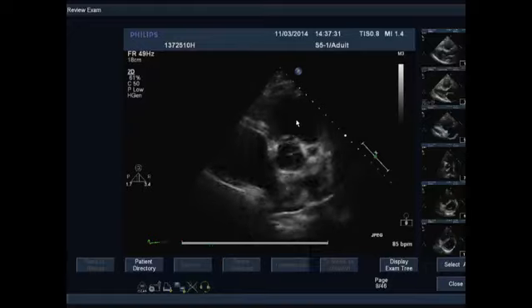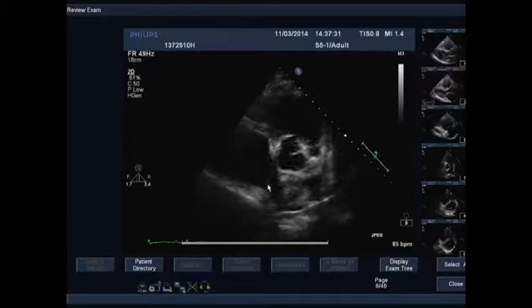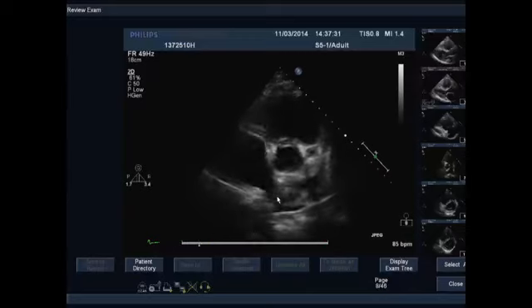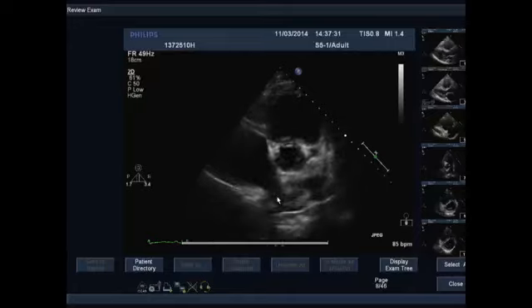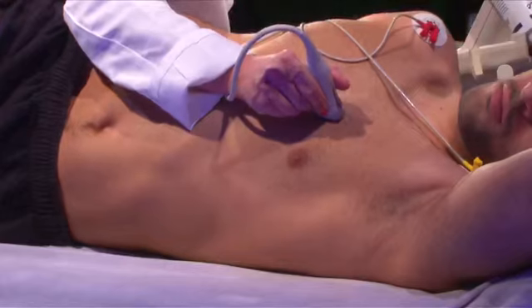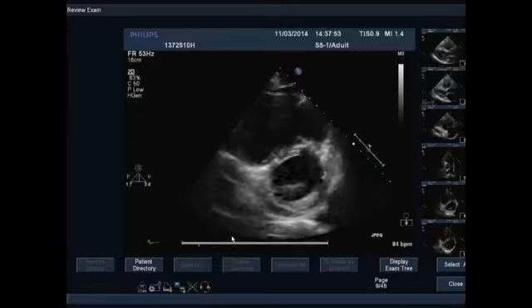It is important that we will see the right ventricular cavity and the tricuspid valve, and also the right atrium. And furthermore, we are able to detect the interatrial septum between the right atrium and the left atrium, and to detect its motion and if that's abnormal or not. It might reveal a cause of volume overload, such as atrial septal defect or a PFO, especially when we apply color Doppler at a later stage. Then by rotating furthermore our transducer towards the right, we will get the parasternal short axis view at the level of the mitral valve.